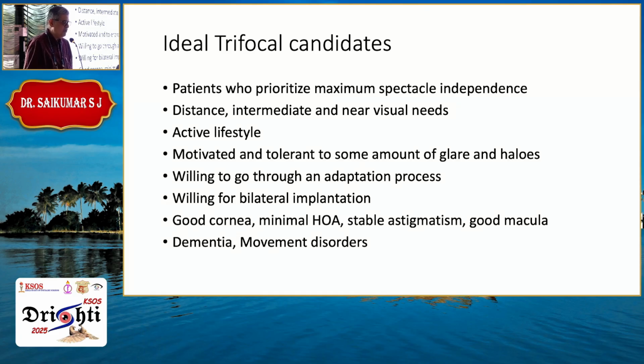So the ideal trifocal candidate is a patient who prioritizes maximum spectacle independence, with distance, intermediate, and near visual needs, and a very active lifestyle so that they don't want to wear glasses most of the time. They are motivated but tolerant to some amount of glare and halos.